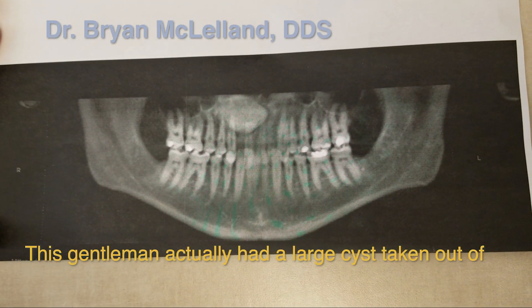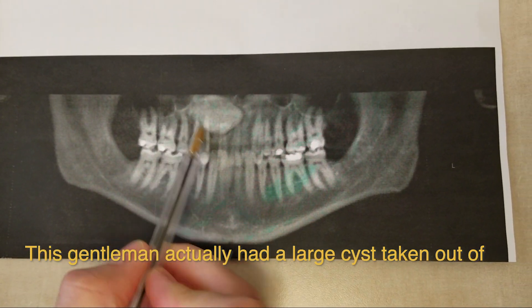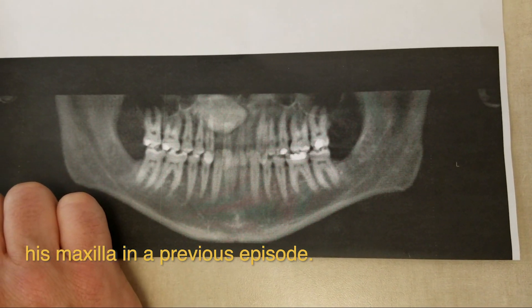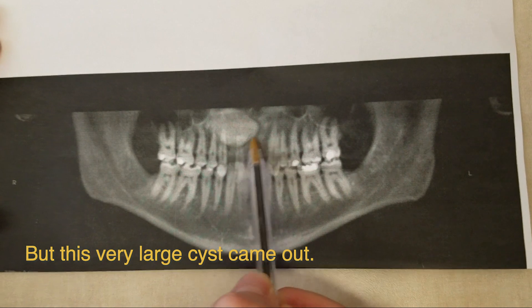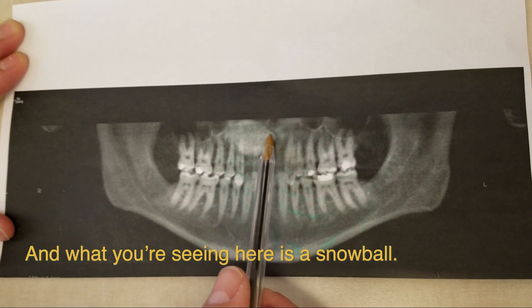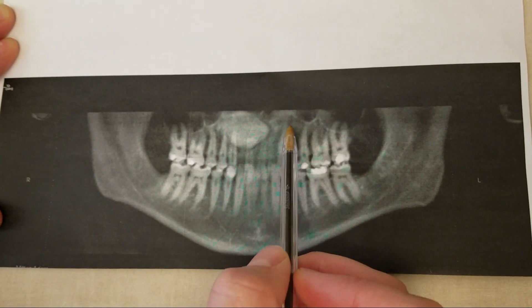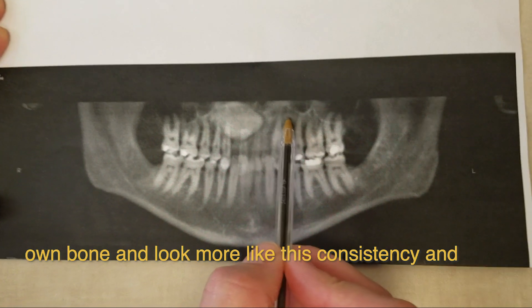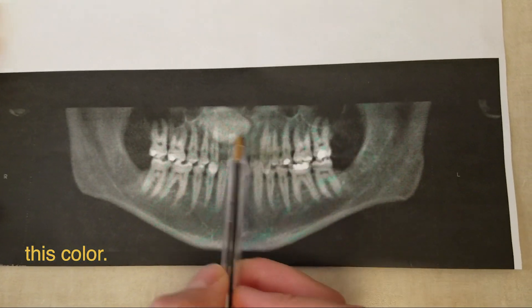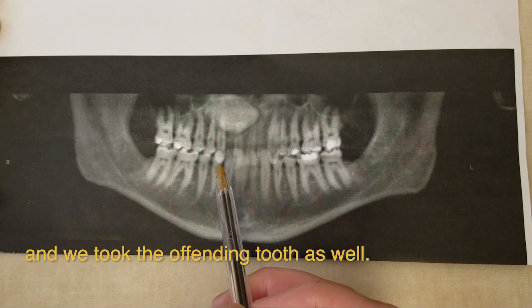Welcome to this week's episode. This gentleman had a large cyst taken out of his maxilla in a previous episode. This very large cyst came out, and we packed bone graft material in here. What you're seeing on this radiograph is a snowball — that's not an official term, that's my term. Eventually it will turn over into the patient's own bone, but for now we have a lot of bone in this area and we took the offending tooth out as well.